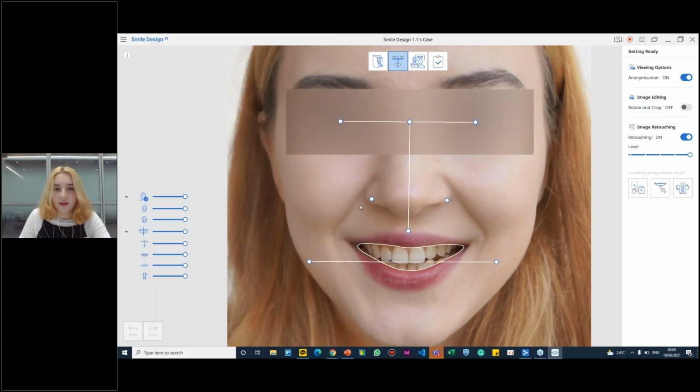I love this concept because it is about presentation on behalf of the doctor, showing the patient potential end results. I think it's really important to give them the best concept of what they could look like, as opposed to seeing flaws and such. Definitely, because Smile Design can show you your new life when you smile, and you want to make sure that you are confident and look nice. I really enjoy having this feature, even though it doesn't cover all of my dark circles, but still, it's a nice addition.